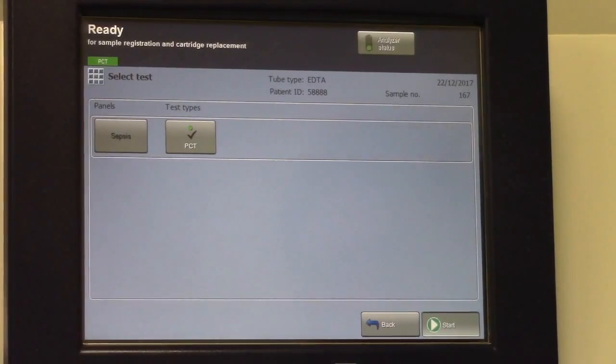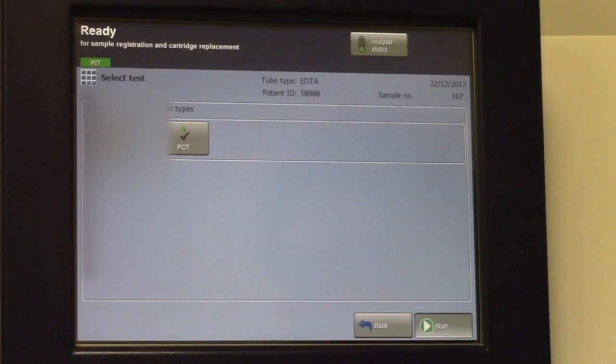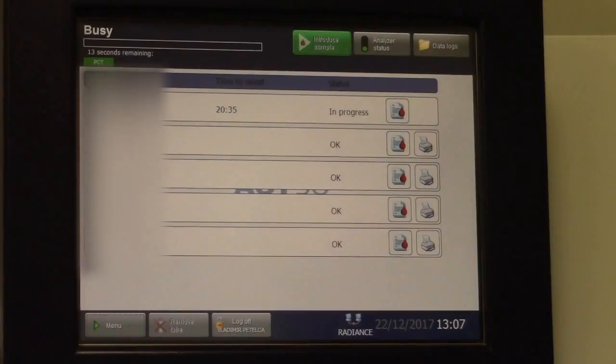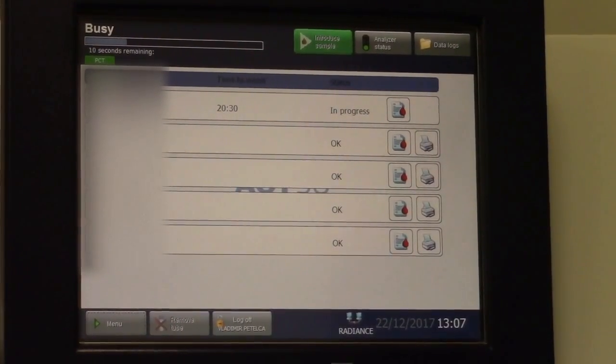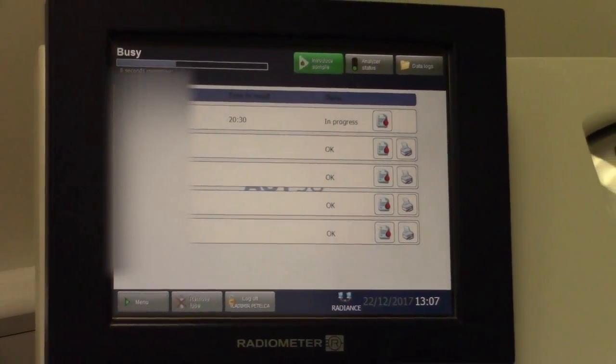Once the sample is loaded, the machine will print out a patient receipt and begin to process the sample. Further samples can be introduced every 30 seconds.